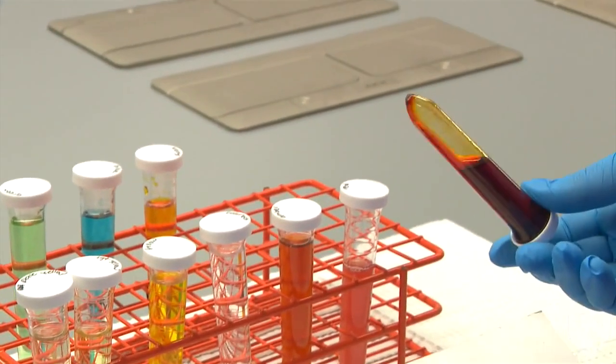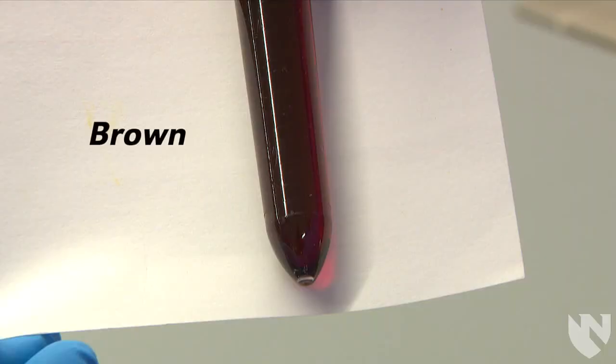This is an example of a brown urine. We report a urine as brown when we see a brown or a dark red brown appearance.